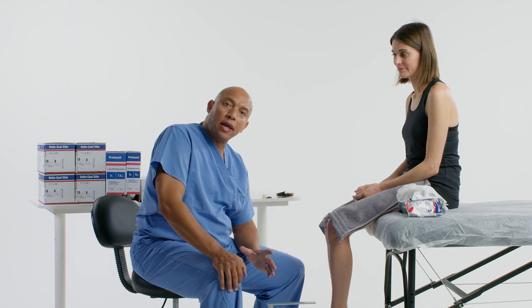Welcome to Deltacast Tutorials. Today I'm going to be doing a short leg cast. Our goal with this is the patient has an injury to their ankle, maybe to their midfoot.